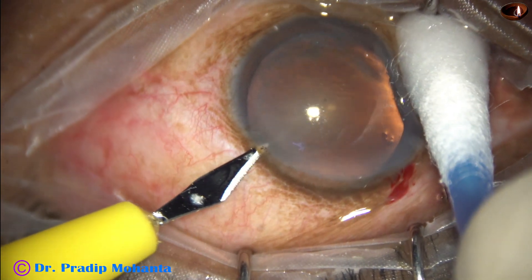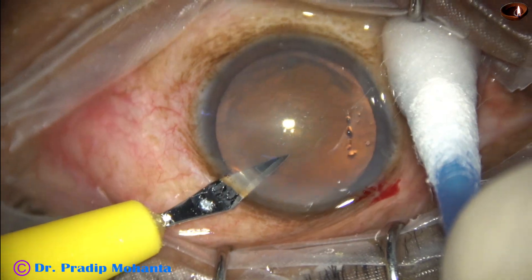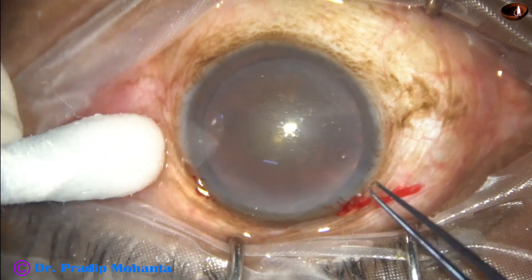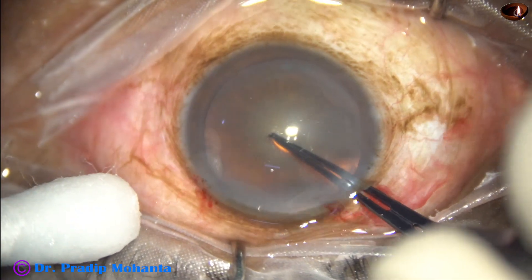In this video, I am going to demonstrate the use of a pre-chopper — first in real speed, then in slow motion.